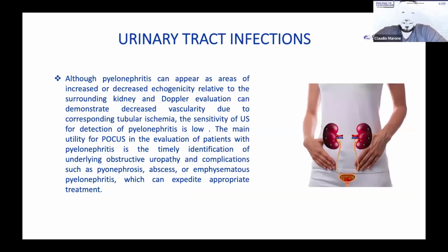About urinary tract infection, we have to say that we are not going to see directly some signs of the infection, but we are going to look for what is inside. I mean, for the underlying obstructive uropathy and for complications like pyonephrosis, abscess, and emphysematous pyelonephritis.